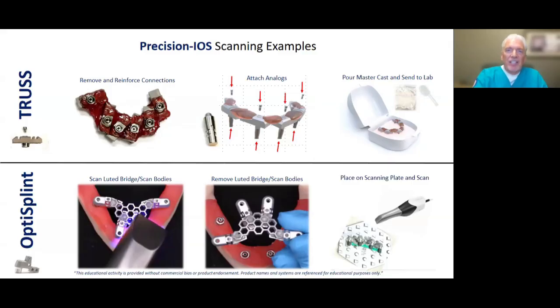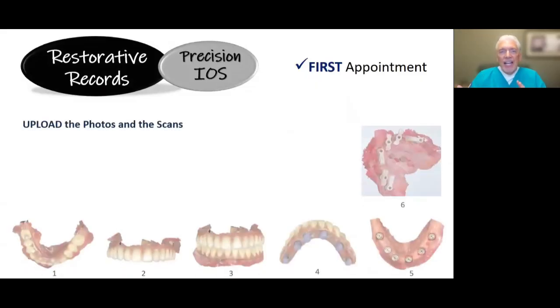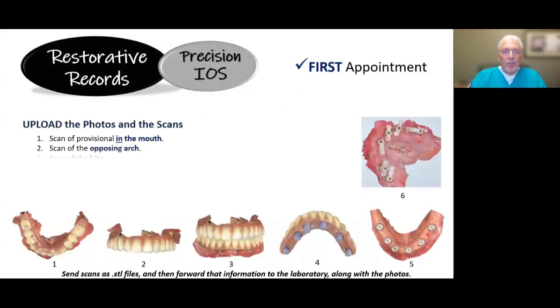And again, I'm not here to dictate what your laboratory should or shouldn't do. I'm just sharing a protocol that works. It's a proven system, how we work, and just to give you a starting point. So once you have all those scans, you're going to upload those photos and the scans to the laboratory.